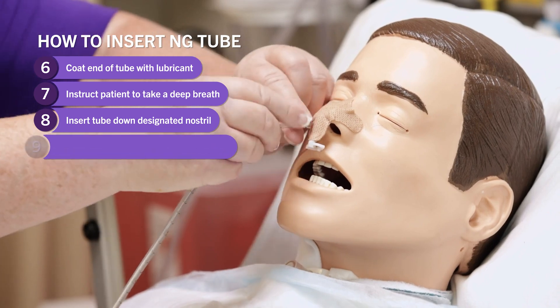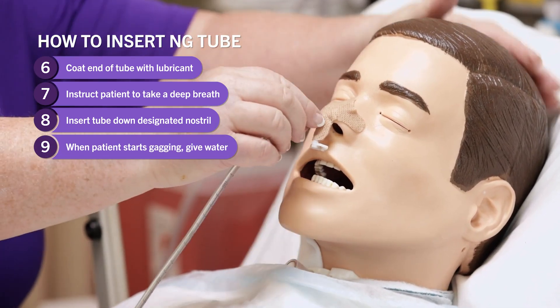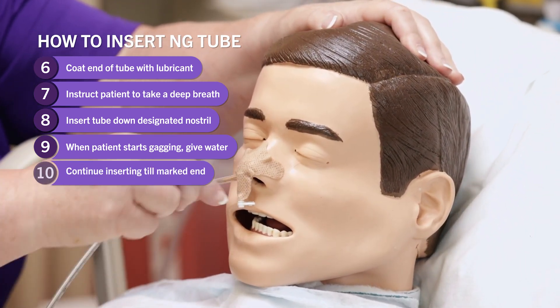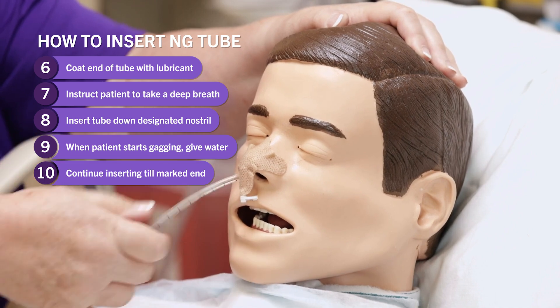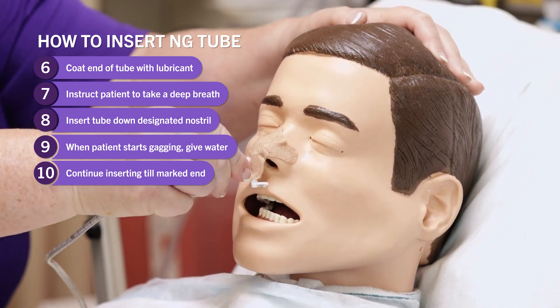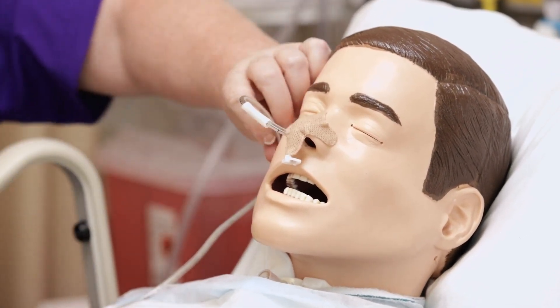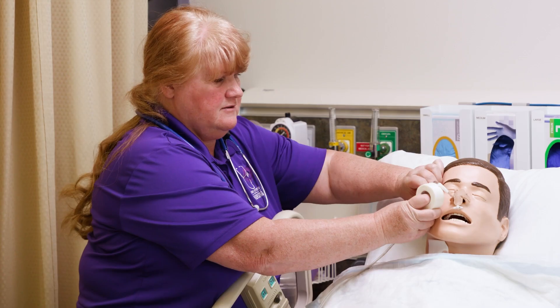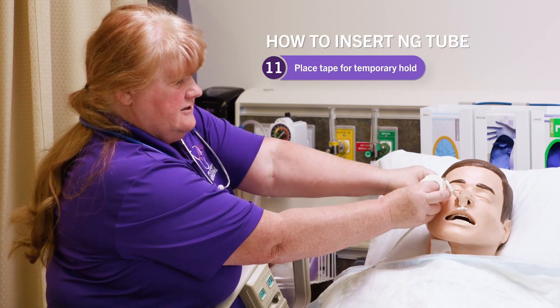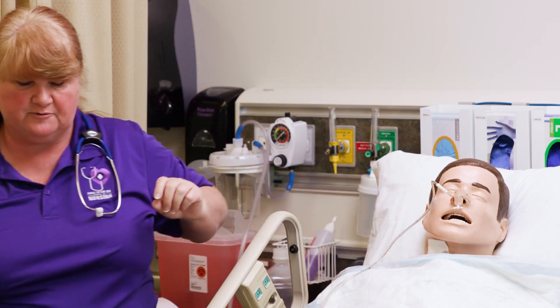When the patient starts gagging, you're going to give him something to drink, and have him tuck his head to his chest. Continue to advance the tube down to where you have marked it. At this point, put some tape on the patient's face, securing it temporarily until you can confirm proper placement.